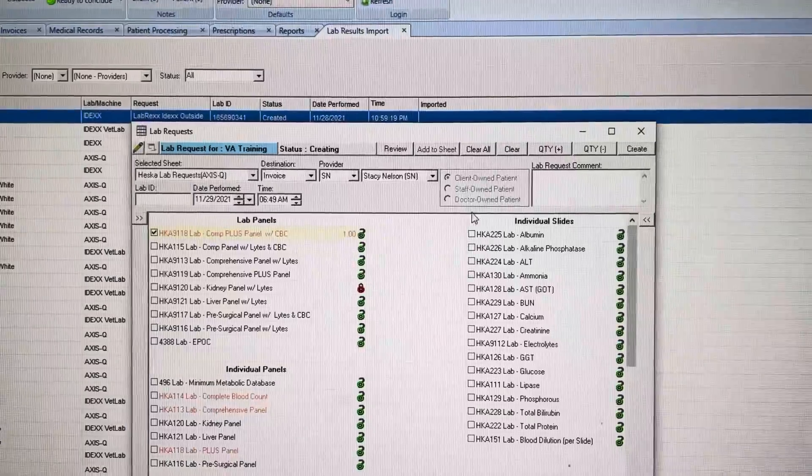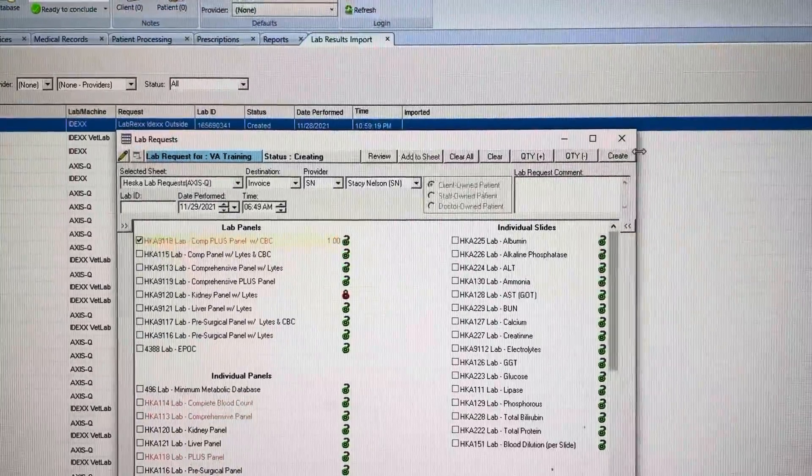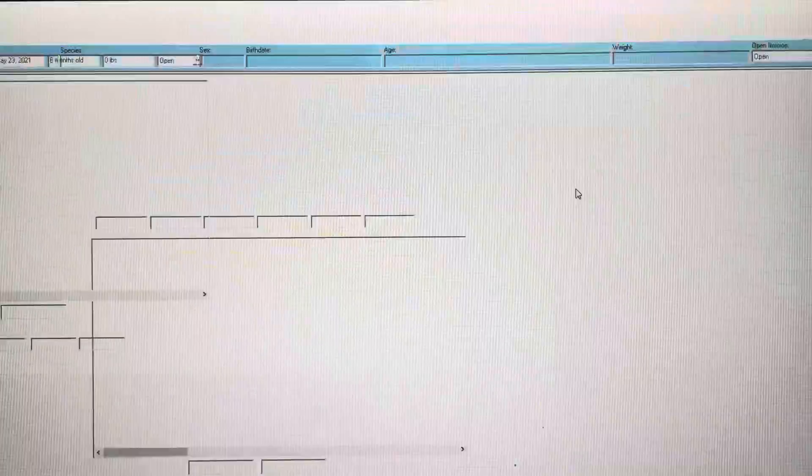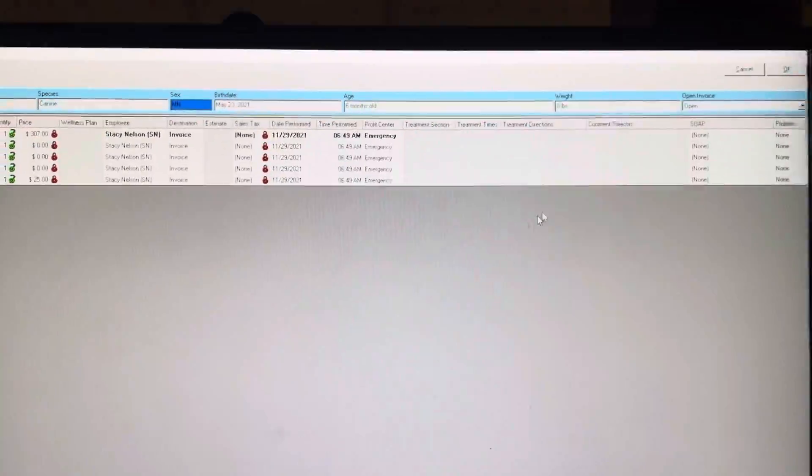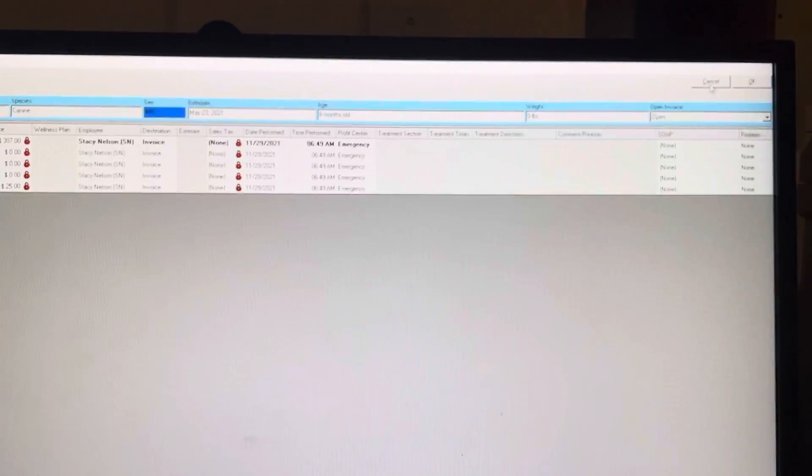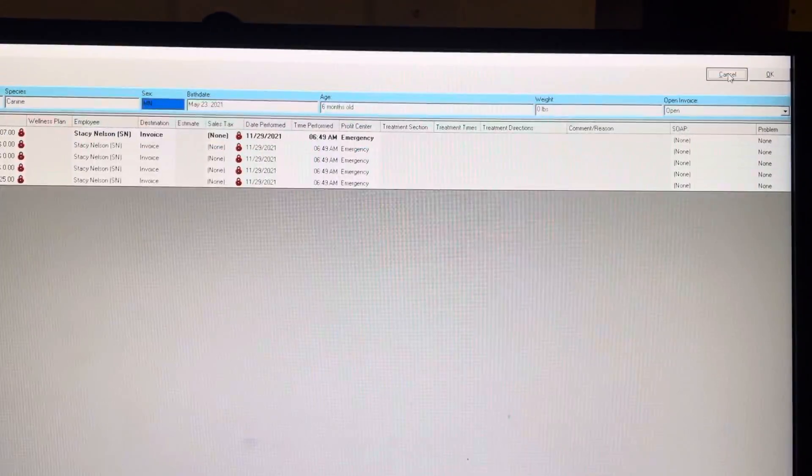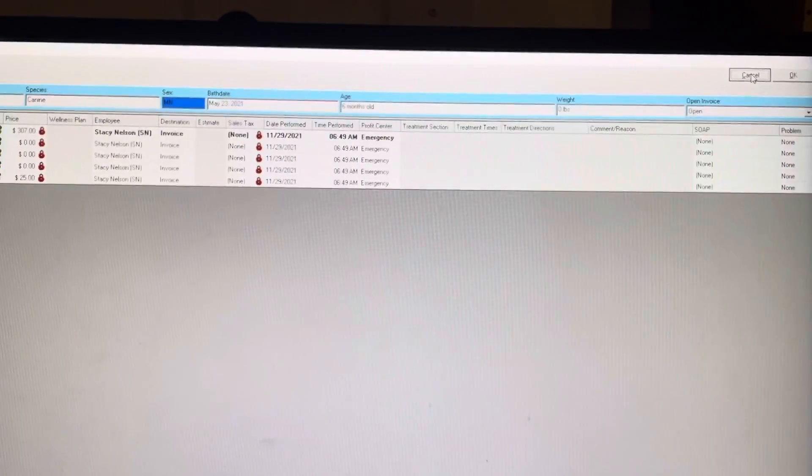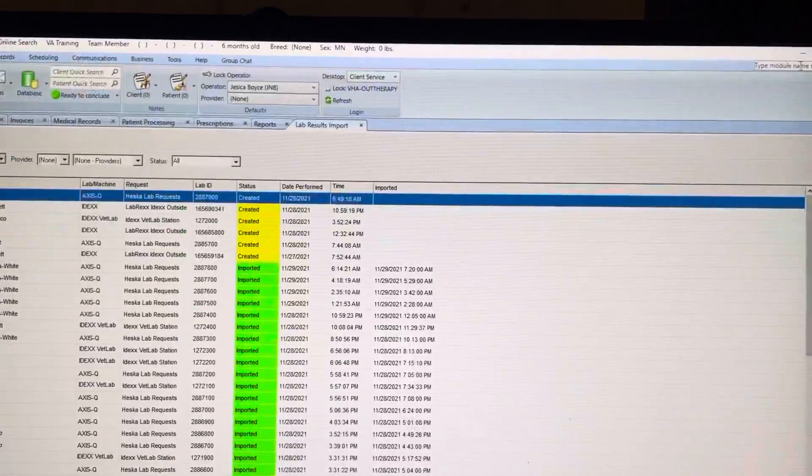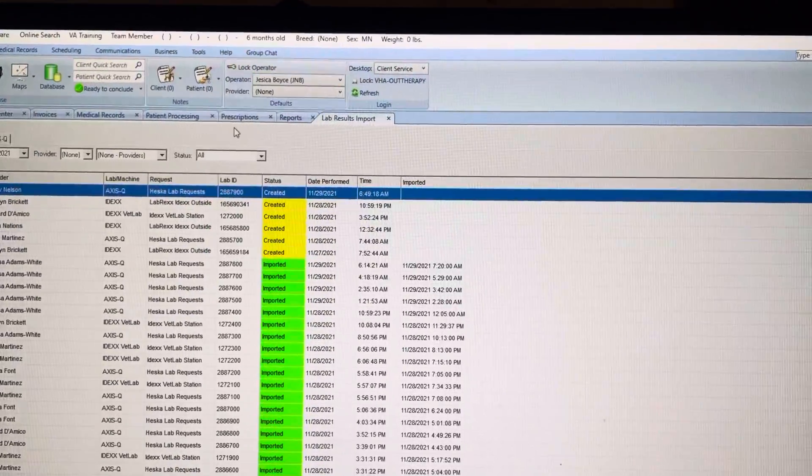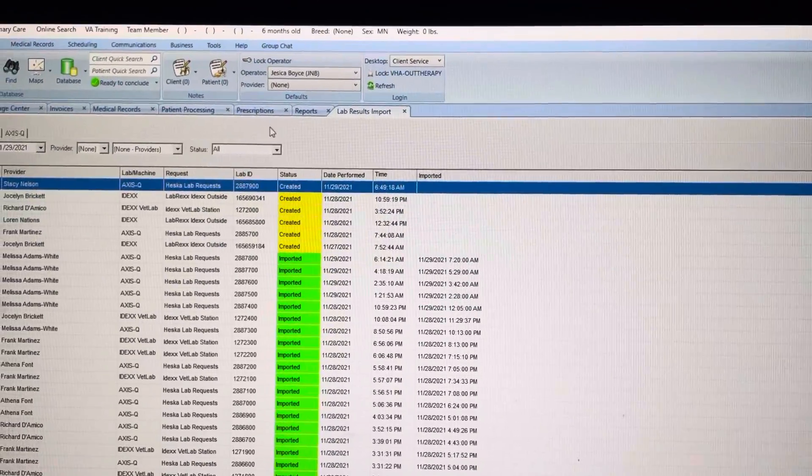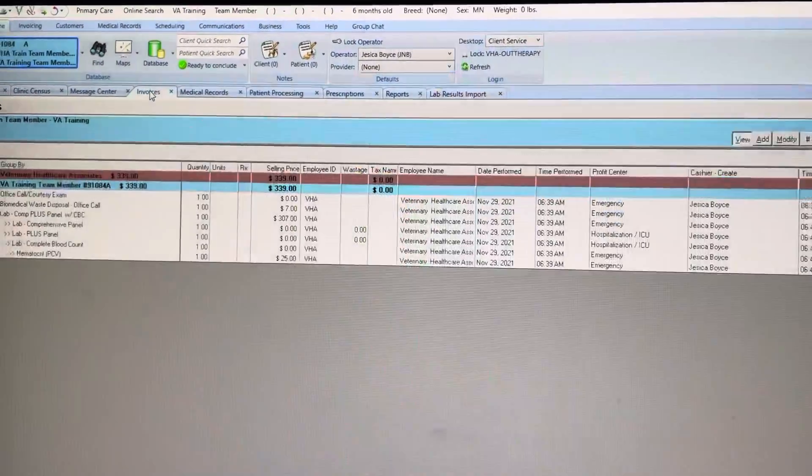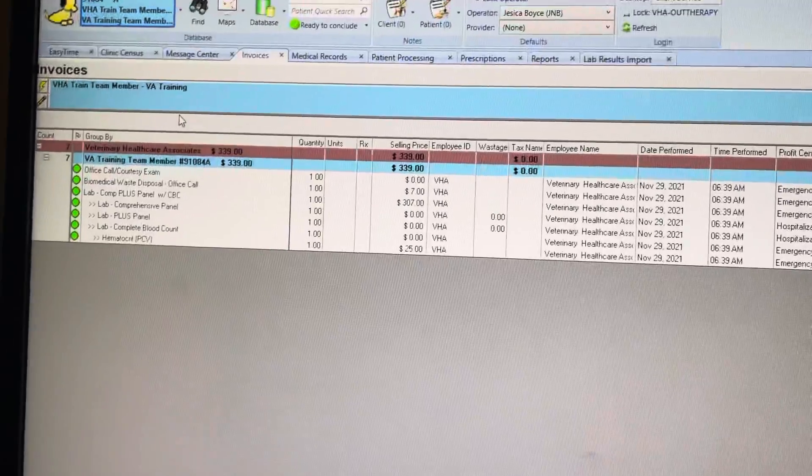Then when you go back here to request your comp plus panel and you hit create, you either need to hit cancel, which the machines will still go ahead and run it for you. If you don't hit cancel, then the owner is going to get charged twice.